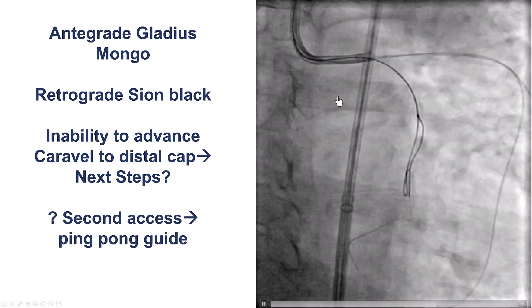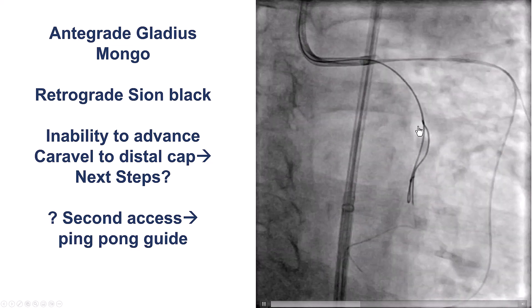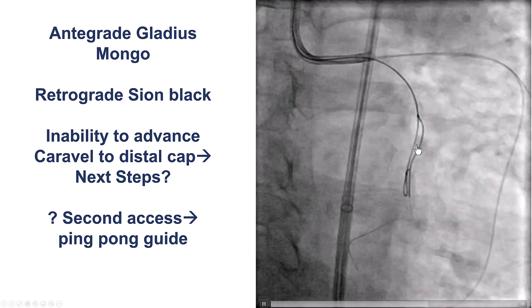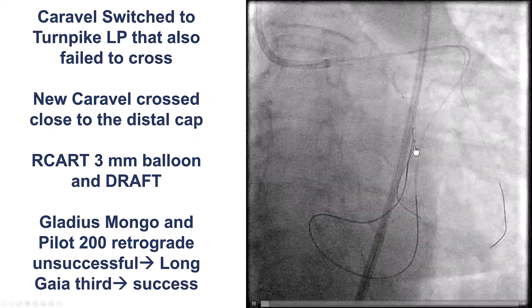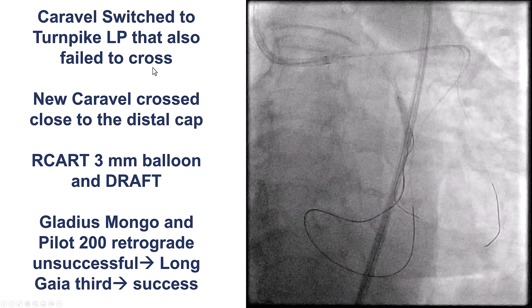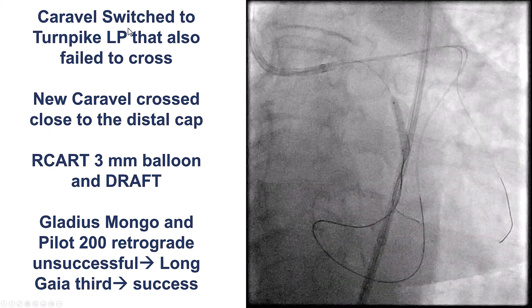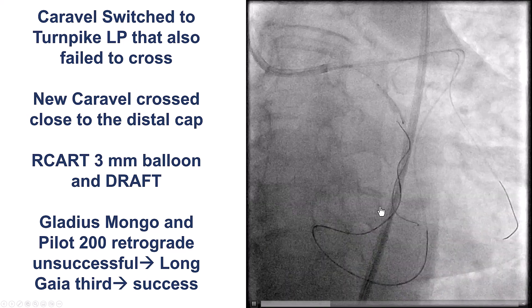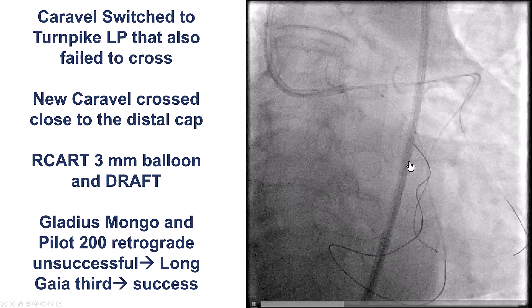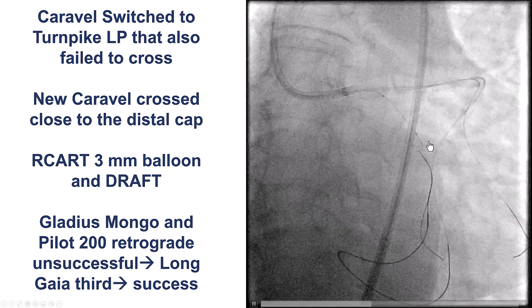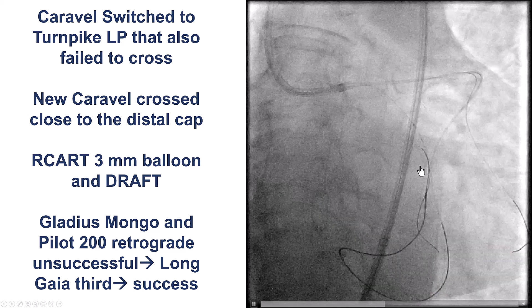We were stuck at this difficult distal cap. What we ended up doing was using a new Caravelle microcatheter, which was able to be advanced essentially all the way to the distal cap. Now we had wires in the distal true lumen and also an antegrade wire overlapping.